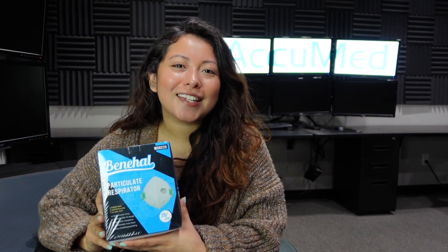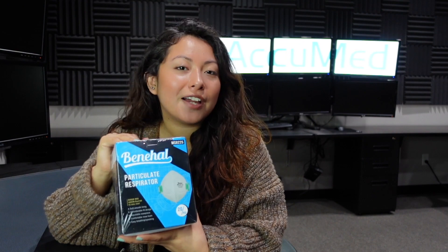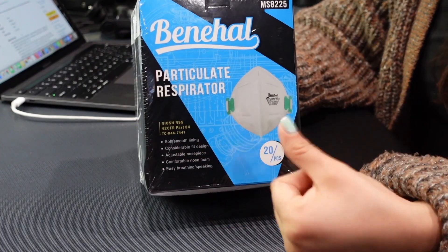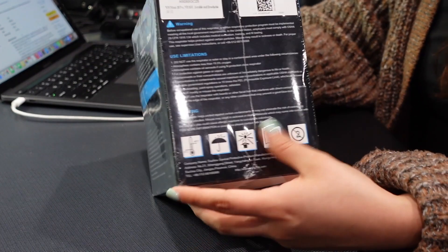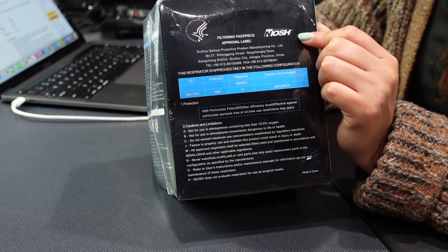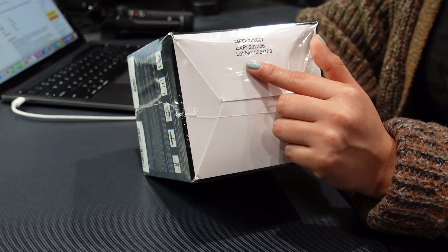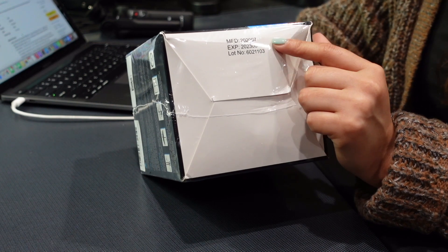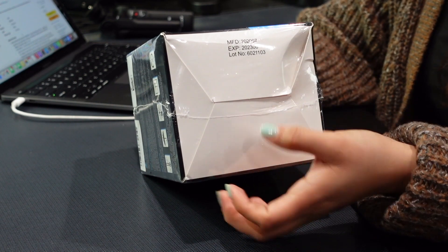Welcome back to the series. We're going to be testing out top-rated face masks sold on Amazon. Today we have an N95 respirator — this is the Benhall MS-8225, and it is a 20-pack. On the box, it comes with the NIOSH proof logo along with the manufacturer and the approval number. On the bottom of the box, it comes with the expiration date along with the lot number, which is 6021103. Let's go ahead and jump into the listing before we try them on.